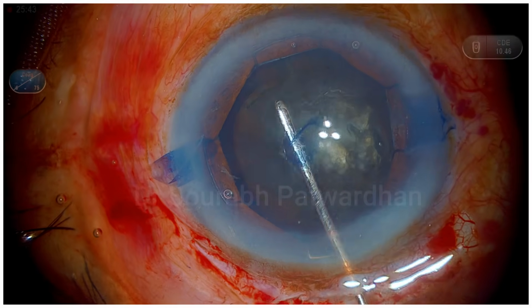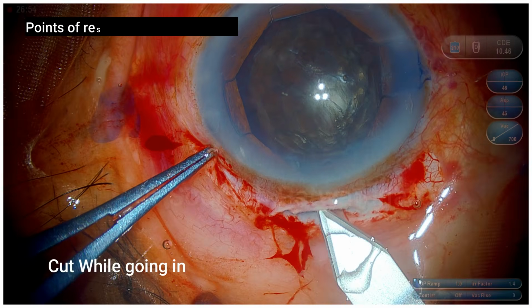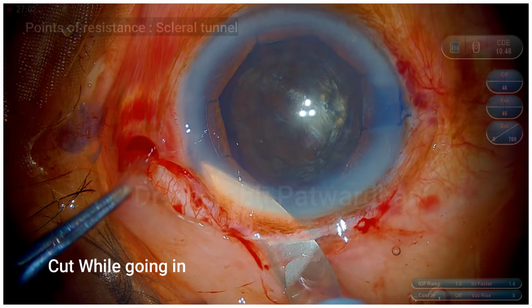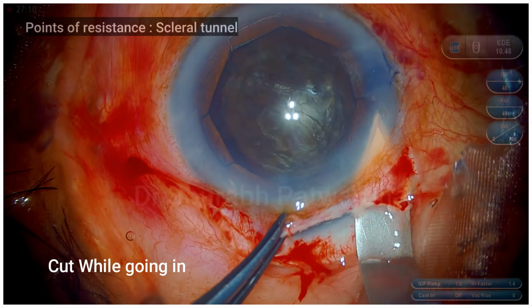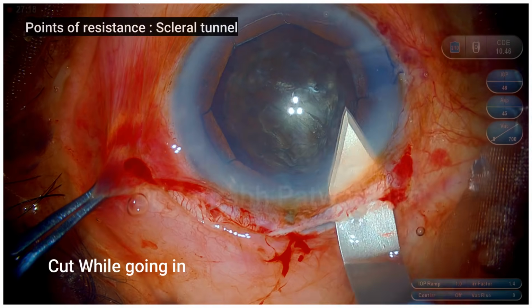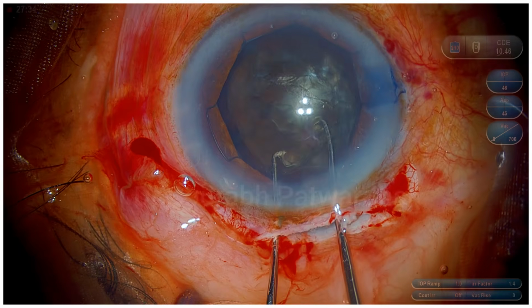Nucleus rotation is achieved, and now I am going to make the final entry through the scleral tunnel. So this is the third point of resistance, which is the scleral tunnel, and you can see I am using this 2.8 keratome, and I am trying to cut while going in. That is important because then you get the scleral entry parallel to the limbus.